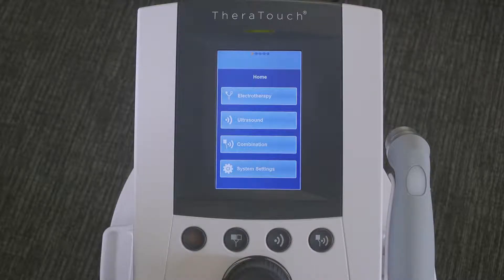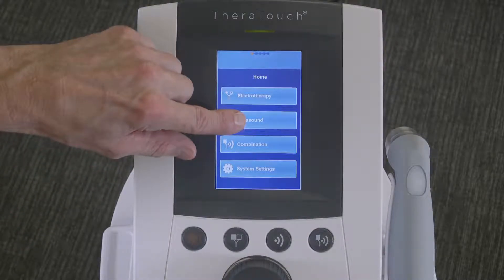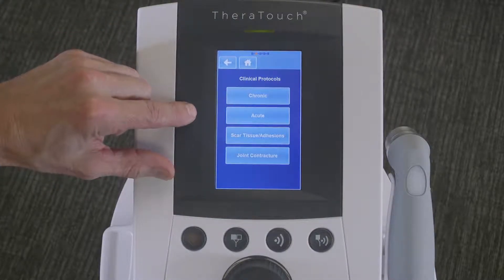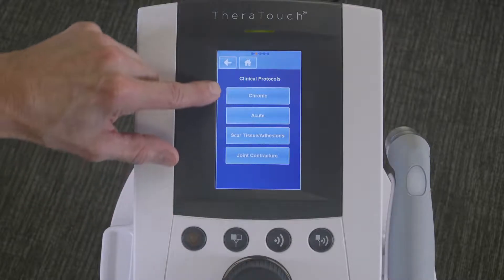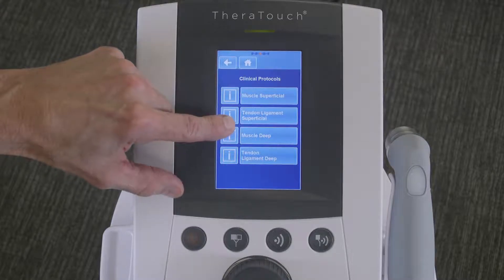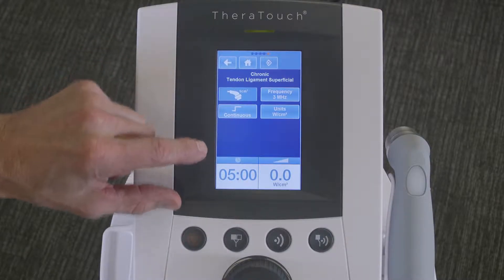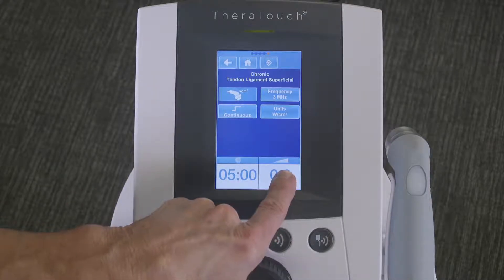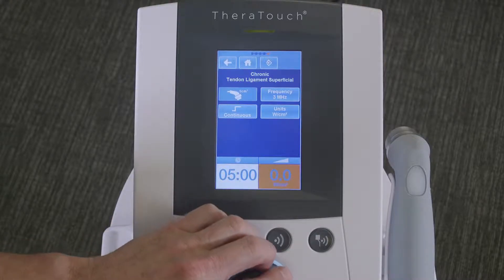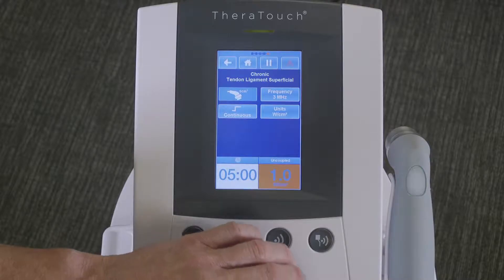Setting up the protocol for this treatment approach: from the home screen, select the ultrasound option, then select clinical protocols. Within the clinical protocol menu, select chronic and then the second option of tendon ligament superficial. Then simply select your intensity knob on the screen so it's highlighted and increase the watts per centimeter squared to one.